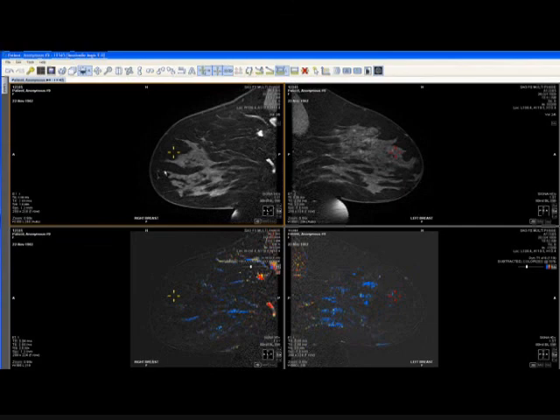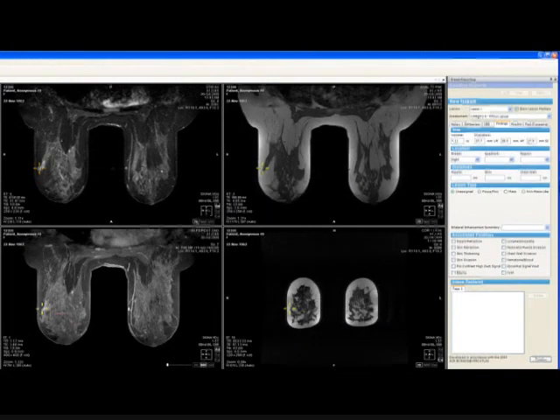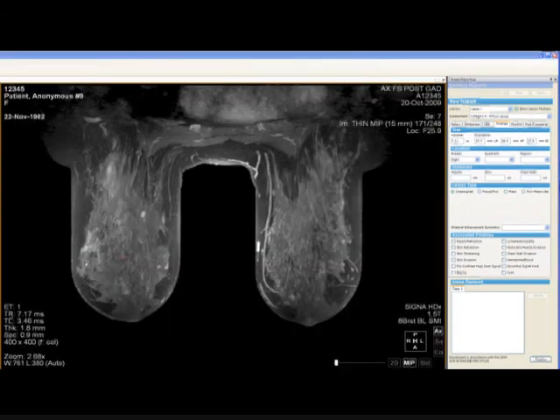at all suspected previously. The question comes up is, what about this nodule that's in a remote quadrant here? It has fairly non-aggressive enhancement characteristics. Cross-referencing this, this is an area that's hyperintense and T2 signal. I can't make out lymph node morphology. And this would be a difficult call here on this delayed acquisition. Lesion looks somewhat irregular in its margins.